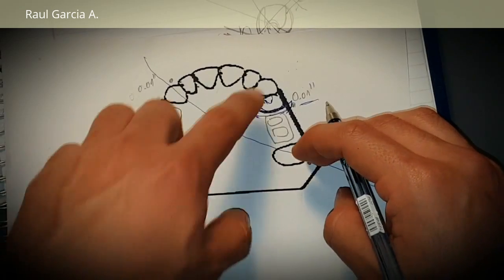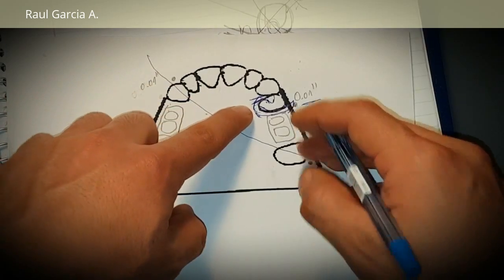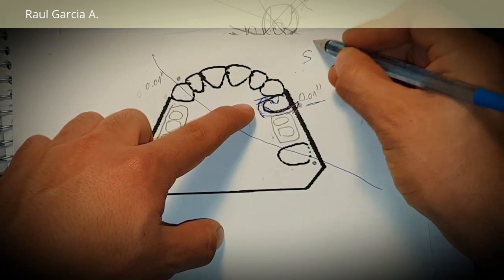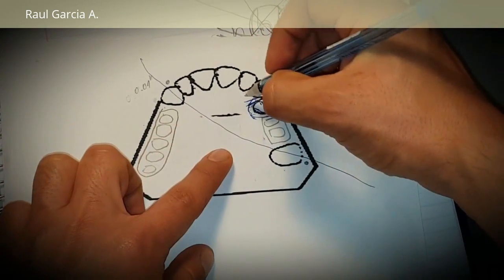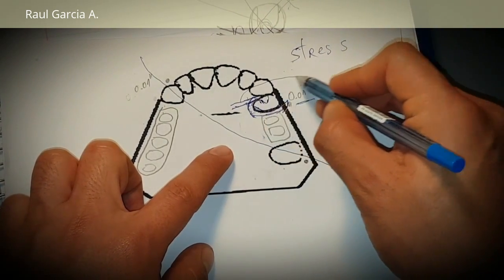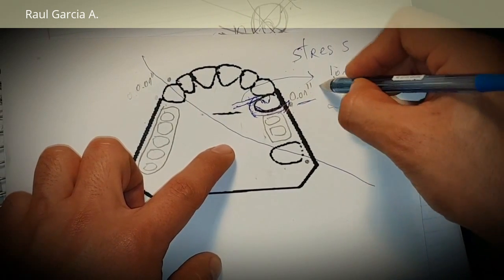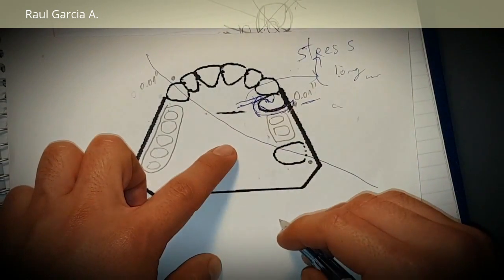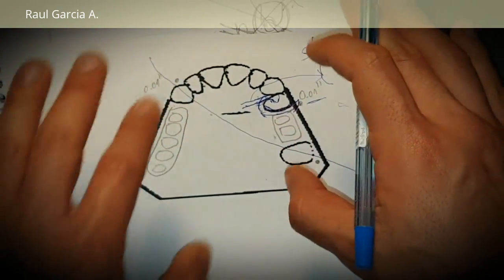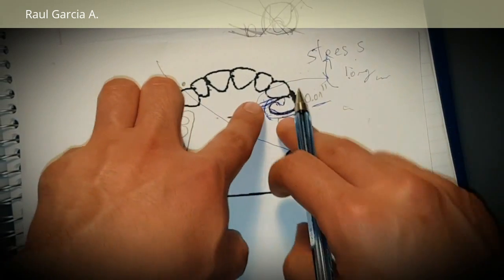You say, okay, I'm using a back action, but this is cast. It's not rod wire. But what was one of the options I told you before that you can use ahead of the fulcrum line to compensate? Stress breaker. So you're going to put a long minor connector. And you have to express it. You have to put it. You have to say it. You have to mention it. Long minor connector working as a stress breaker. If you don't say this, if you don't put this on your design, it will cause damage to the patient.